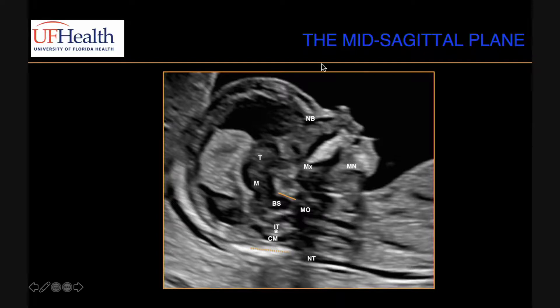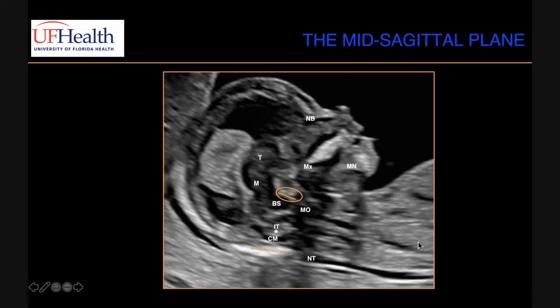Here is the perfect midsagittal plane where you can see the frontal bone, the skin, and the tip of the nose. This is where we measure our NT, and as we've seen, this is where you see your nasal bone, maxilla, mandible, thalamus, and sphenoid bone. Dr. Sinkovitskaya very elegantly described the difference transabdominally and transvaginally in the appearance of the brainstem due to shadowing from the sphenoid bone — be very mindful of that as well. You can also identify the midbrain, brainstem, medulla oblongata, the future fourth ventricle with choroid plexus, the cisterna magna, and the occipital bone.